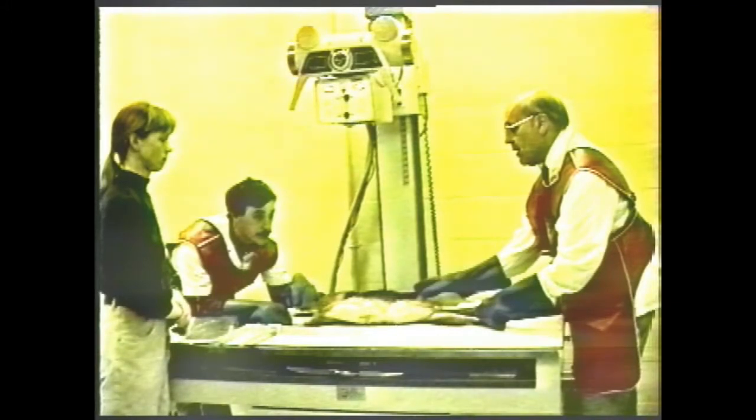You'll notice that the two individuals that are preparing to restrain the animal are protected by using lead gloves, lead aprons, and they have their badges outside the lead apron around the neck area. The third individual, who is assisting with the positioning by measuring, will then leave the room, set the machine, and make the exposure.